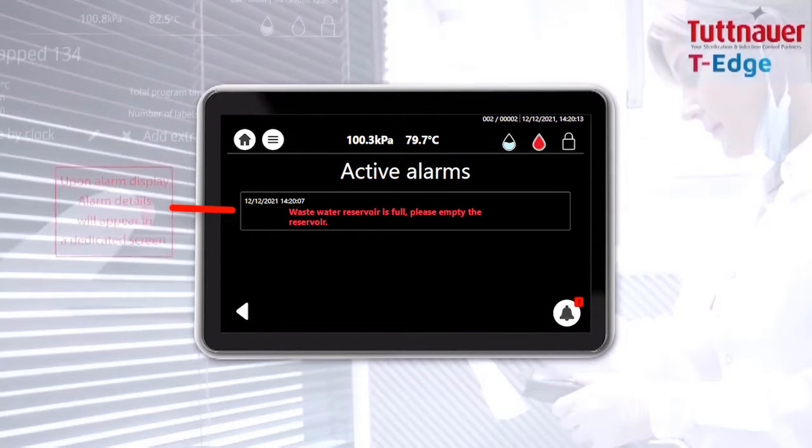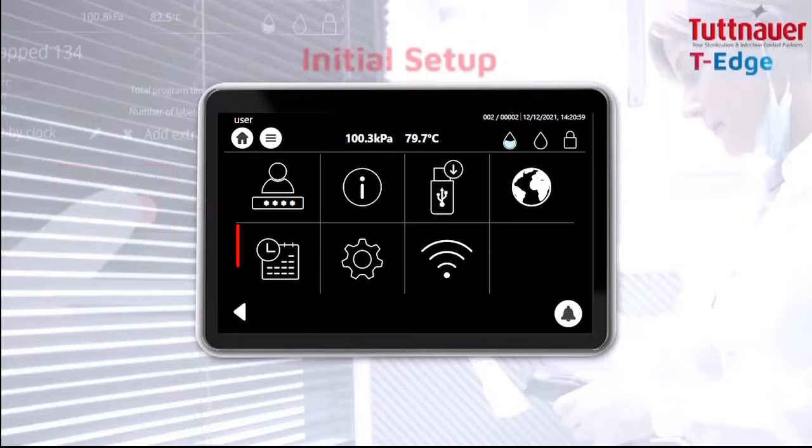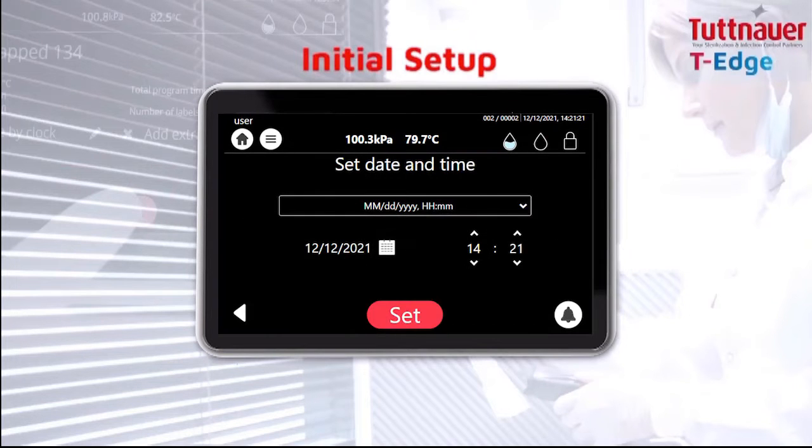Upon alarm display, alarm details will appear in a dedicated screen. When T-Edge powers on for the first time, set up the date, time, and language.